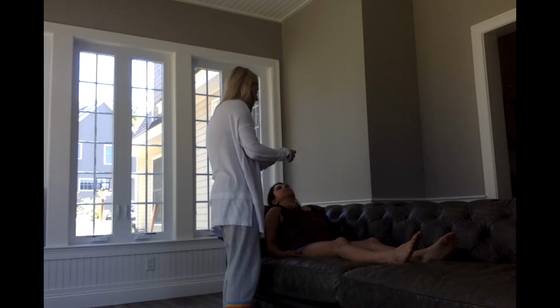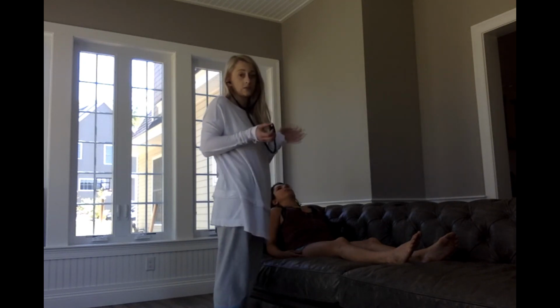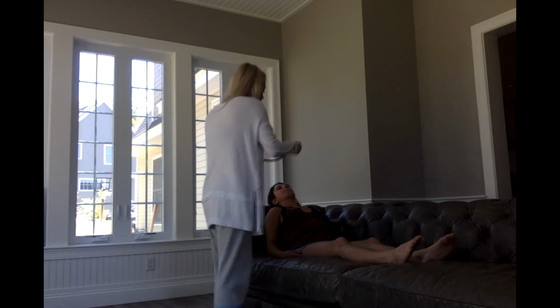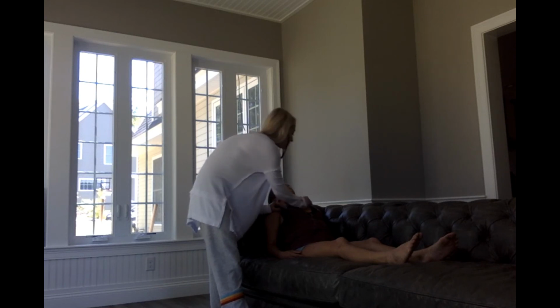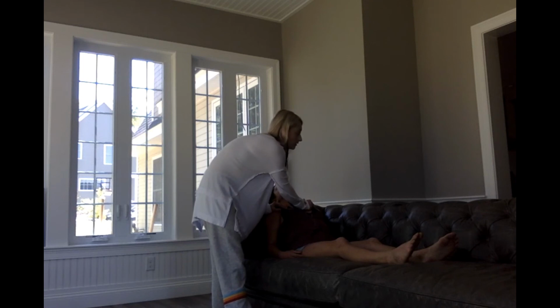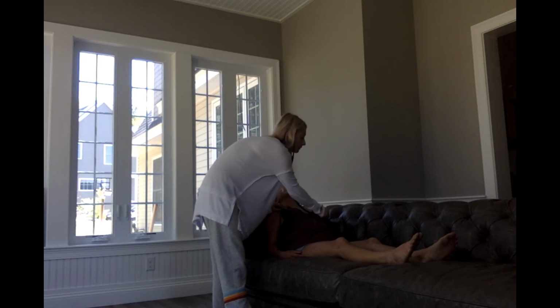Okay, sounds good. Now we're going to repeat the same thing using the diaphragm of the stethoscope. So aortic on the right, second intercostal space. Pulmonic on the left, second intercostal space. Erb's, third. Tricuspid. And then the fifth, which is the mitral.